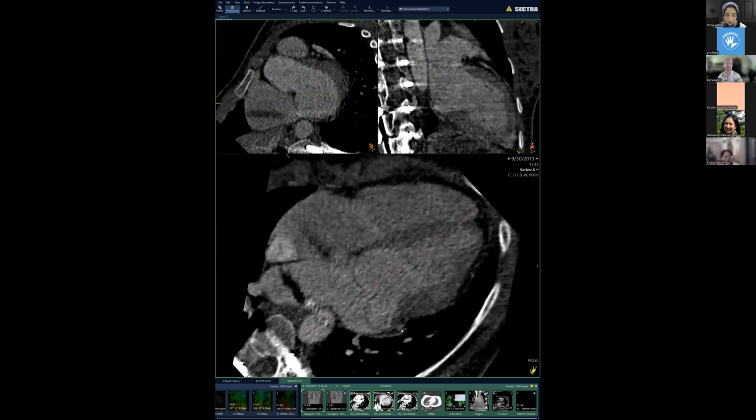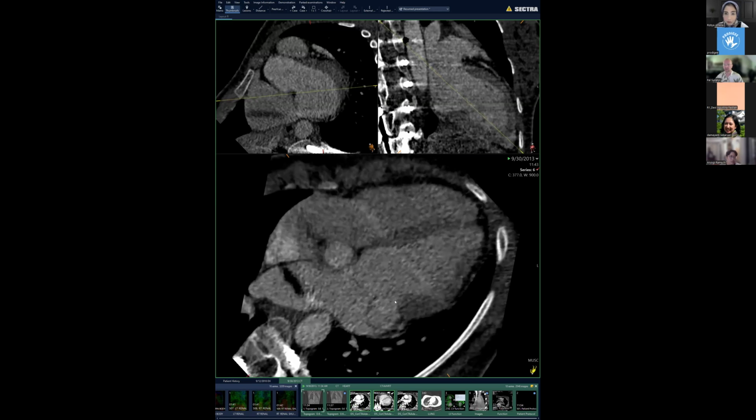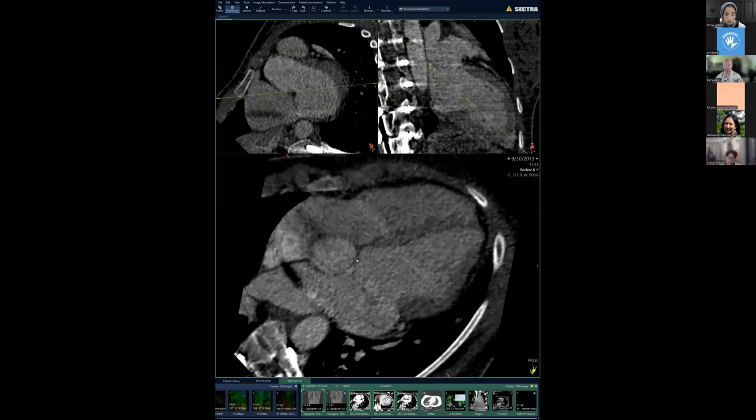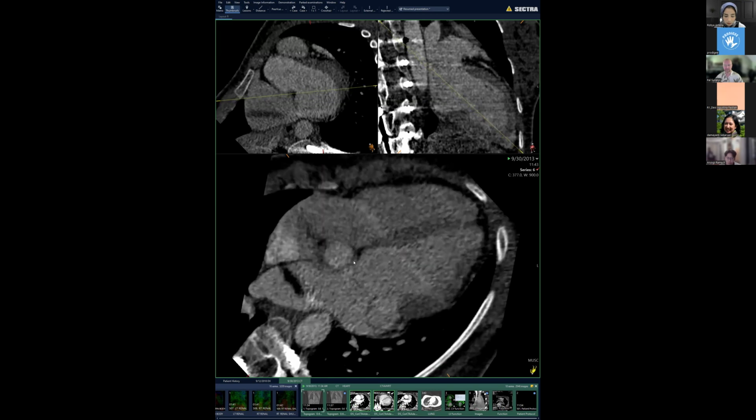We previously discussed that the mitral valve has two leaflets, and each of the leaflets have three scallops, A1, 2, 3, and P1, 2, 3. And sometimes there's isolated prolapse of certain leaflets, whereas others are relatively normal. Again, here our anatomic landmarks are going to be the point where the mitral and aortic annulus meet, right here, and laterally, again, where the myocardium stops. So here, now we can actually draw a line and get an actual measurement of the prolapse. Some people give about a 3 millimeter leeway that's accepted as normal. We have 20 millimeters of prolapse in this case.